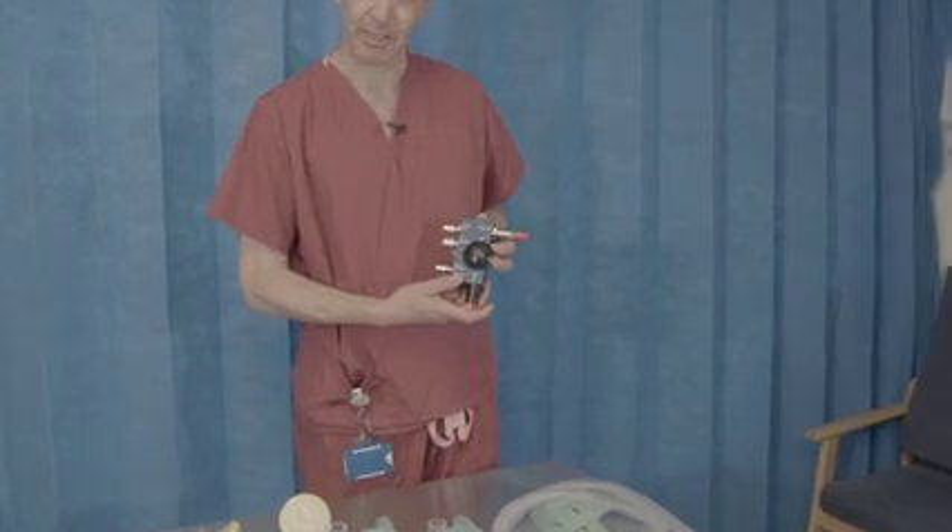Hello, my name is David Brearley. I'm one of the intensive care consultants here at University College Hospital, and today I want to take you through the setting up of the new Ventura CPAP system.